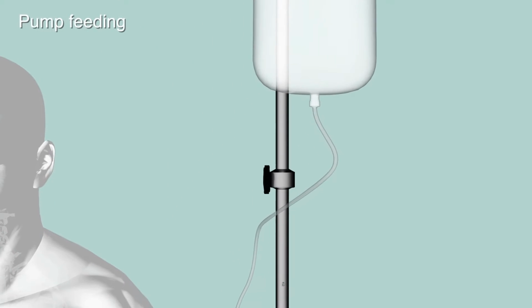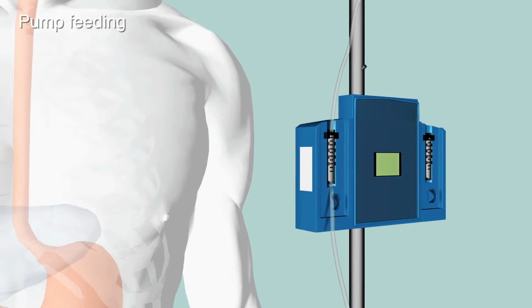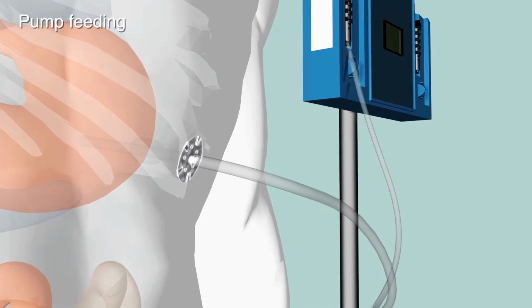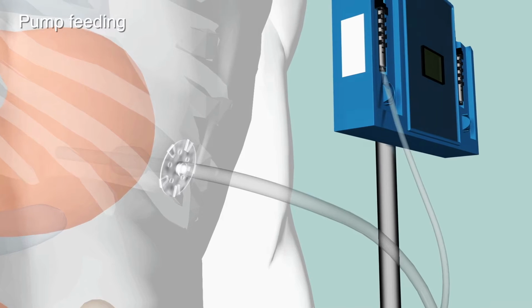Pump feeding is sometimes known as continuous or intermittent feeding, where formula is given over several hours. Water flushes are often given a number of times during feeding.